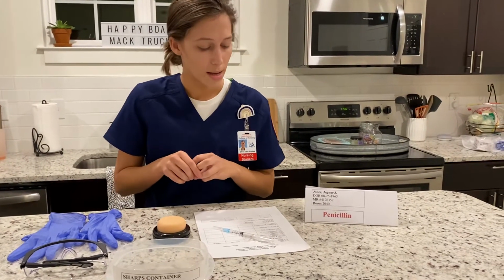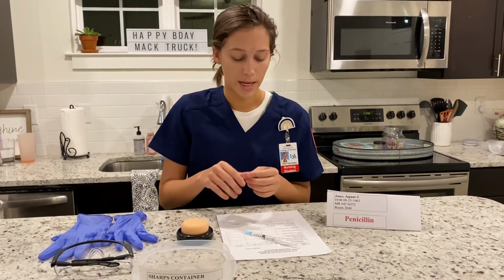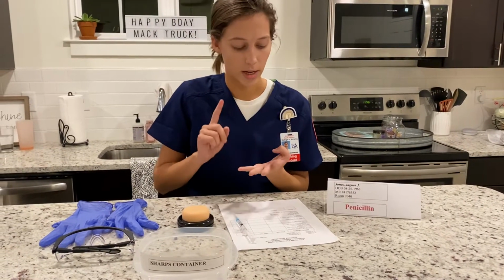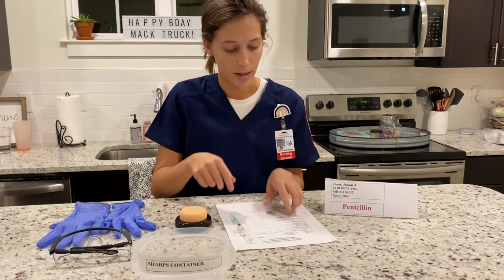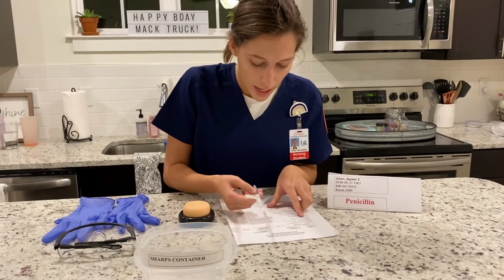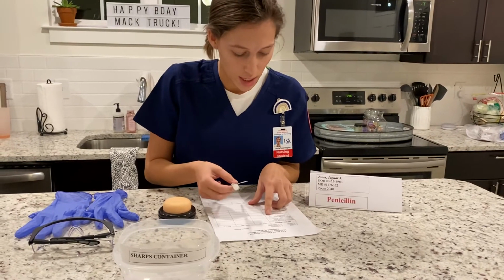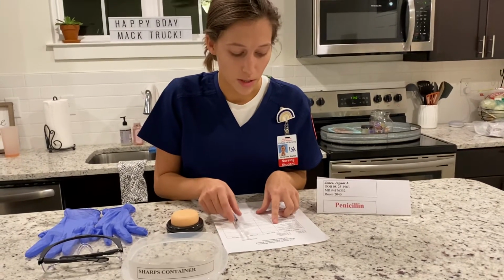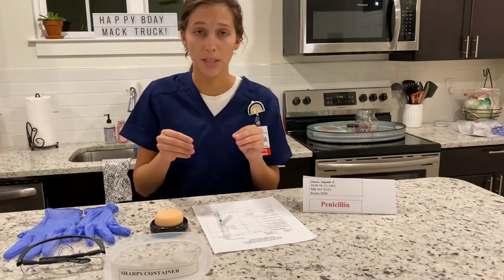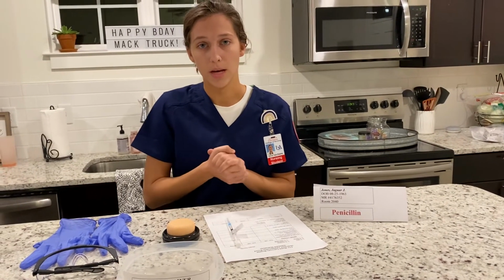And now I am going to perform my third check of accuracy, again using the 5 rights: the correct name, correct drug, correct amount, correct route, and the correct time. So his name is Jaguar Jones. He's going to be receiving heparin, 5,000 units, 0.5 milliliters, subcutaneously with the TB syringe every 12 hours, and he has not been administered his medicine in 12 hours, so we will be administering that now. And next, I'm going to explain the procedure to the patient, making sure he's aware of when I'm going to be giving the medicine.